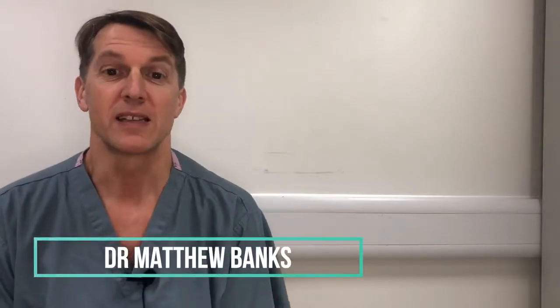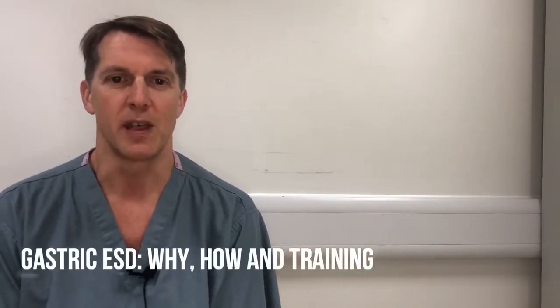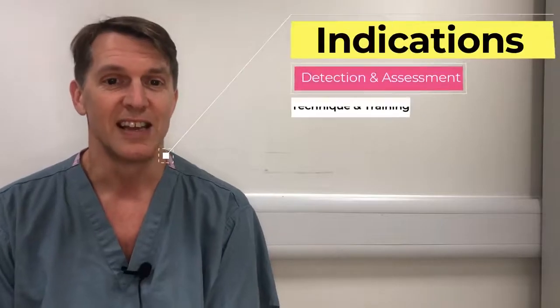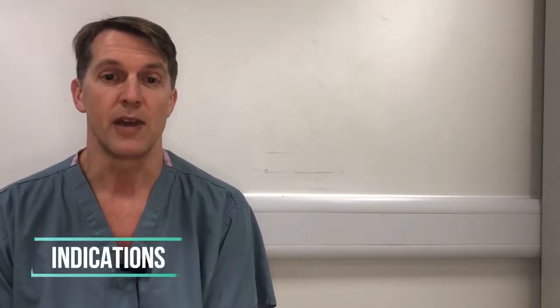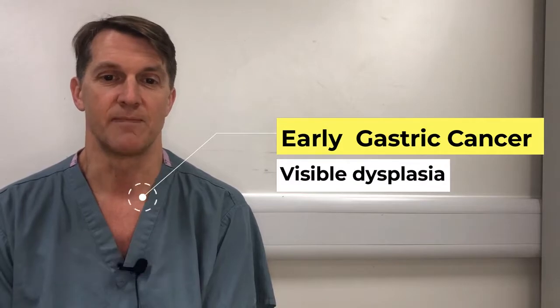I'm Matthew Banks. I'm a consultant gastroenterologist at University College London Hospital, and I'm going to talk to you today about endoscopic submucosal dissection, ESD, specifically in the stomach. And I'm going to cover the indications, detection, lesion assessment, the technique of endoscopic submucosal dissection, and a little bit about training. Now, the indications for ESD in the stomach are either early gastric cancer or visible gastric dysplasia.